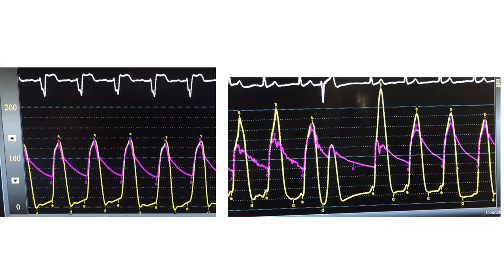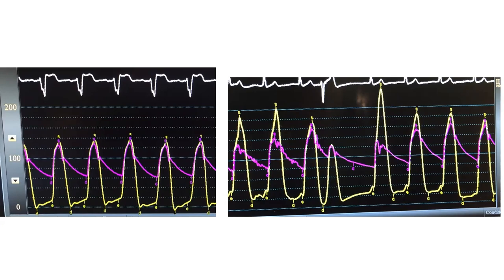Another feature of dynamic LVOT obstruction is that the gradient is dynamic spontaneously. Look at this tracing — same patient. At one point during cardiac catheterization, there is no gradient. At another time of the study, outside of a PVC, all of a sudden a gradient appears. Even outside maneuvers, you start to have that late dagger LV shape — very peaky, very narrow — and spike and dome spontaneously. Within 10 seconds, you had obstruction, then no obstruction. That is very characteristic of HOCM. It is important to be patient when recording in a patient where you suspect dynamic LVOT obstruction — you need to record over several minutes.